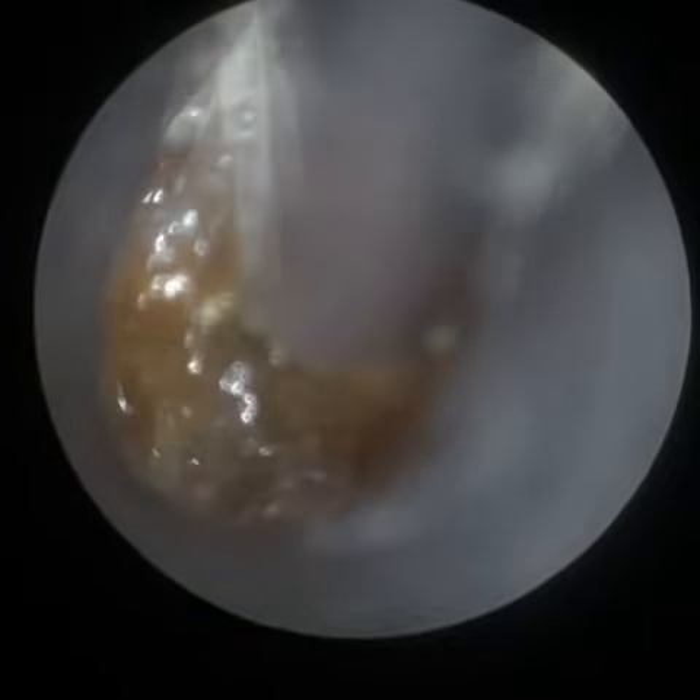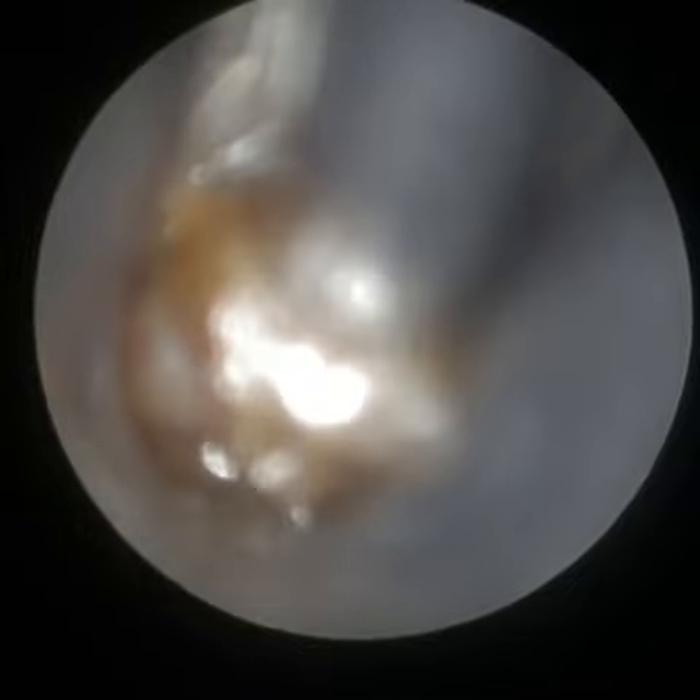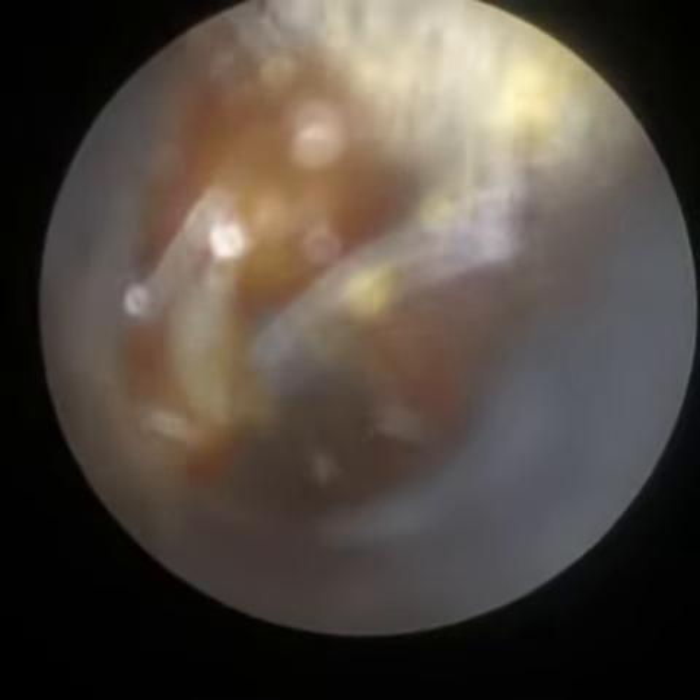This wax, which has been softened with drops prior to the patient attending — the patient I do some olive oil spray — it was impacted on the eardrum, so we're quite medial there. There's just some residual wax at the entrance of the ear, so I'm just getting that in focus. You can see how quickly I'm able to do that.